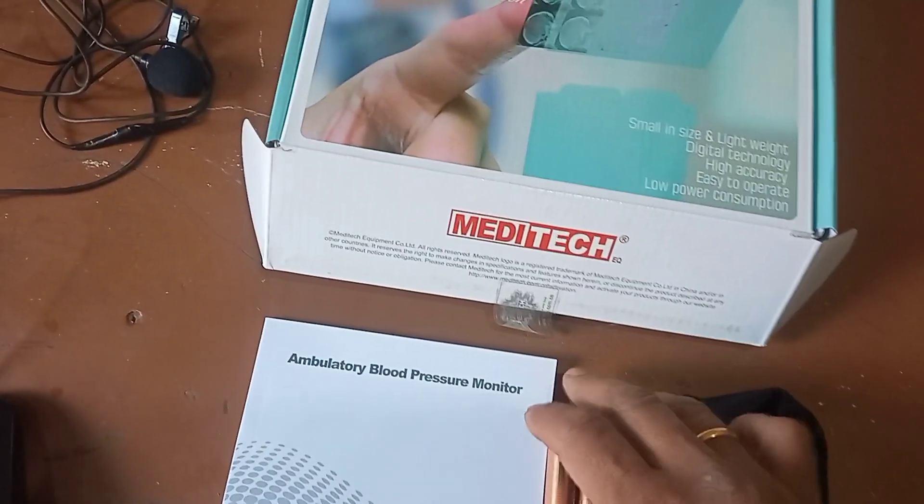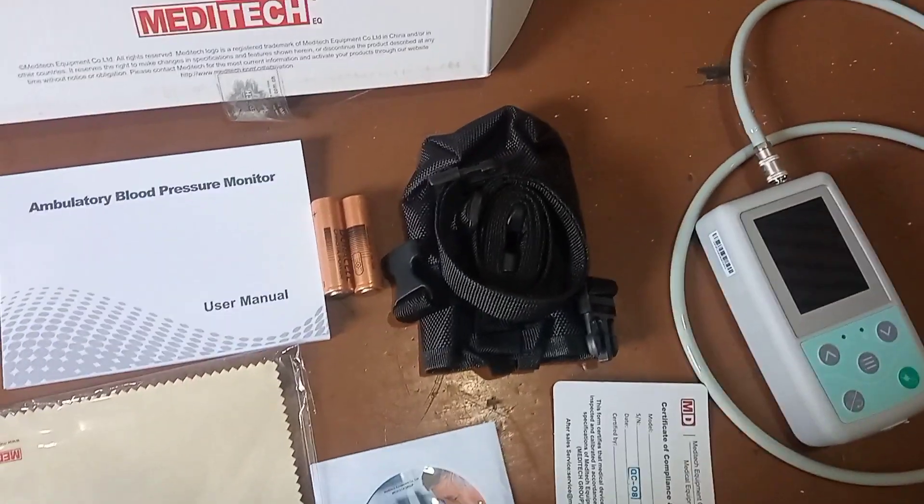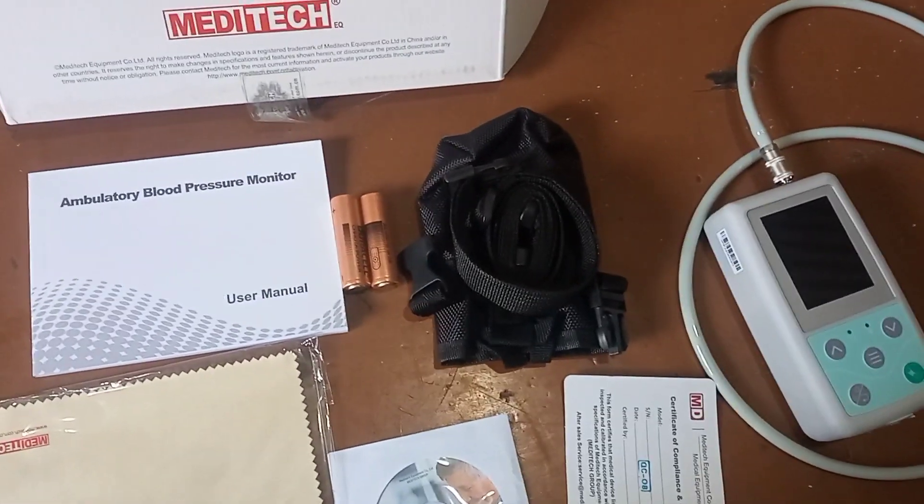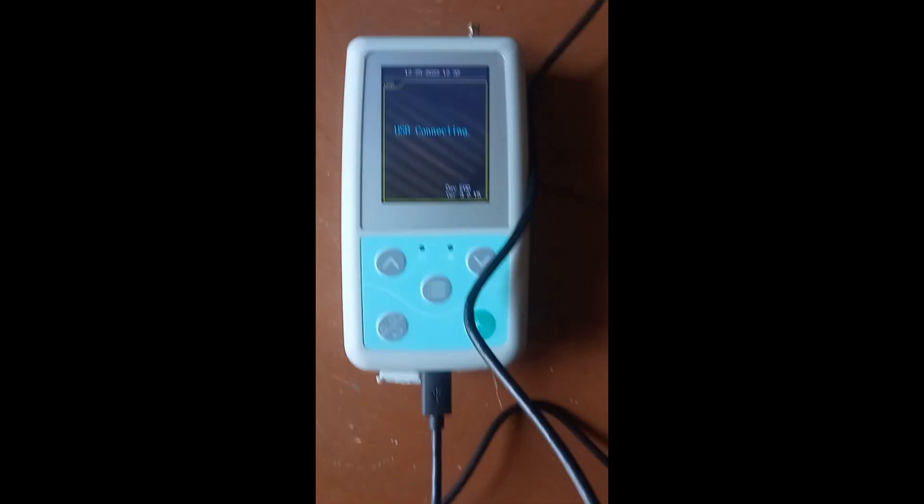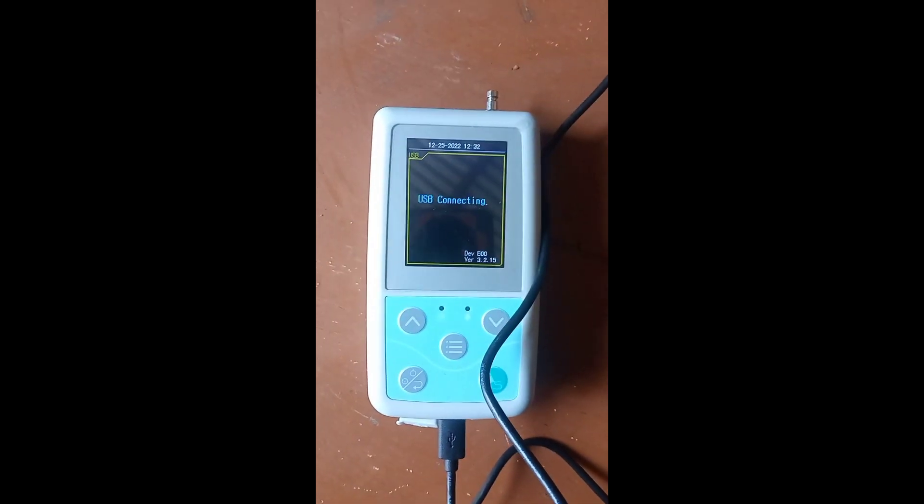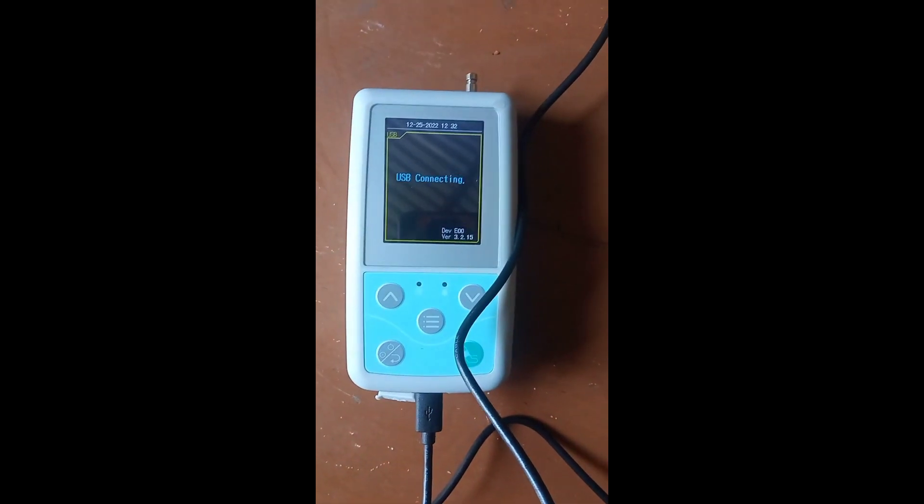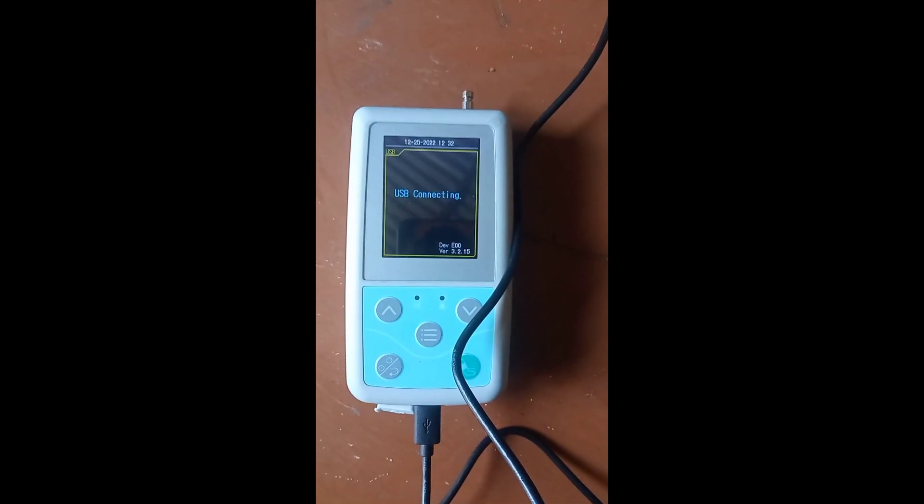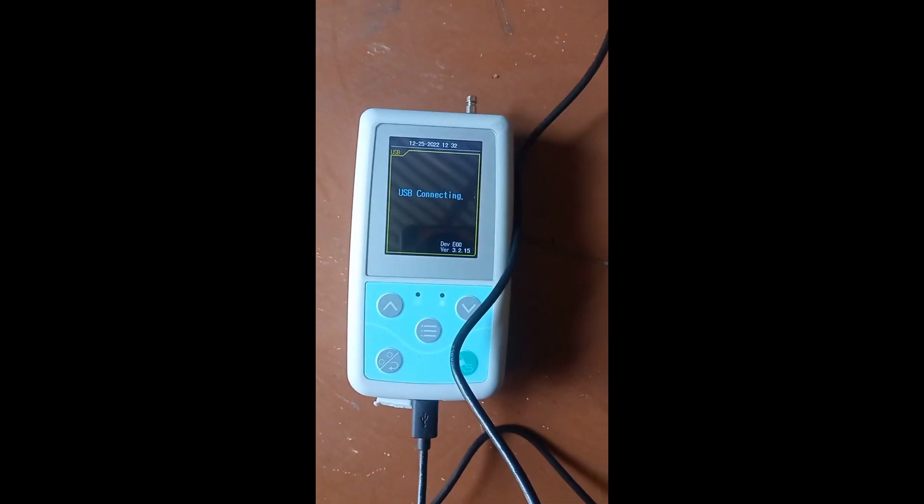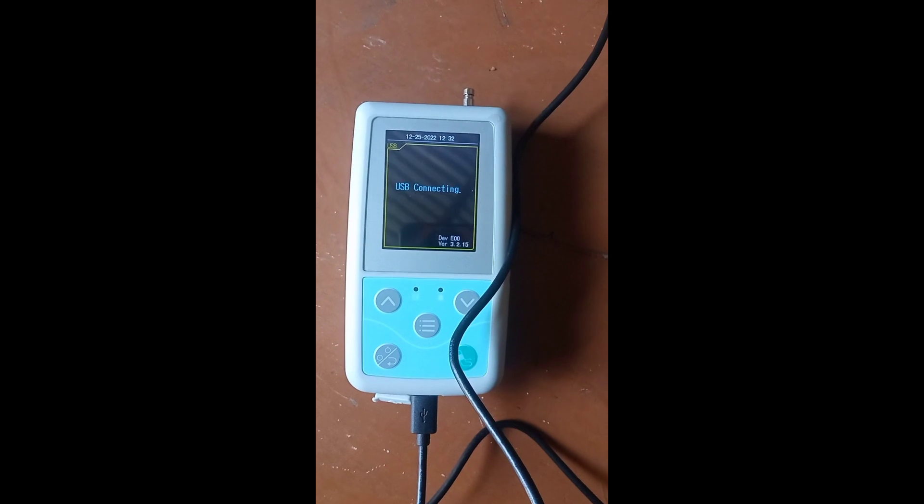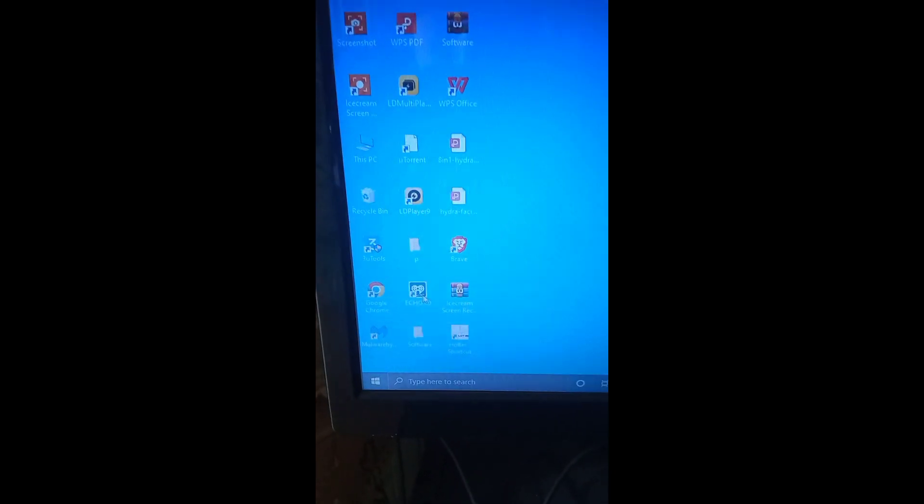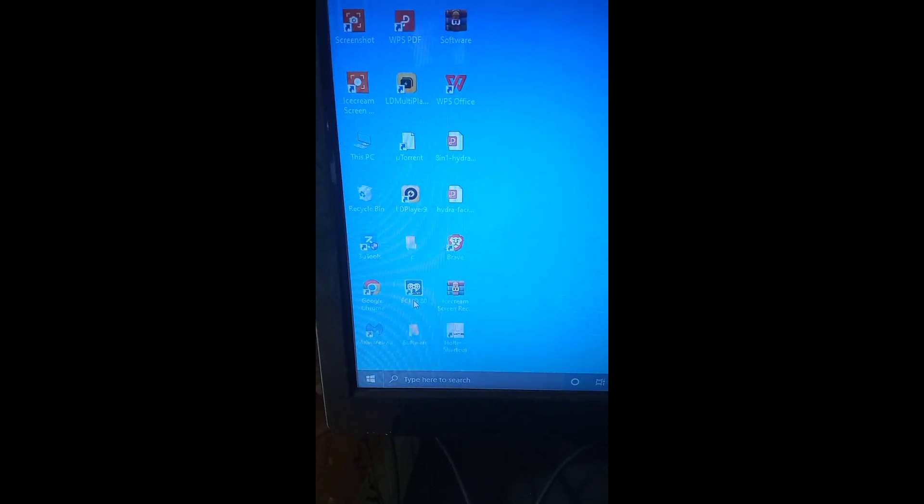USB connection must be done when the power is on. You should not do it in the off condition. The system should be on, and after that, in the computer you can go to the eco80 software.